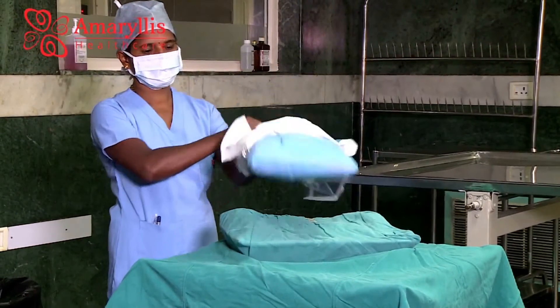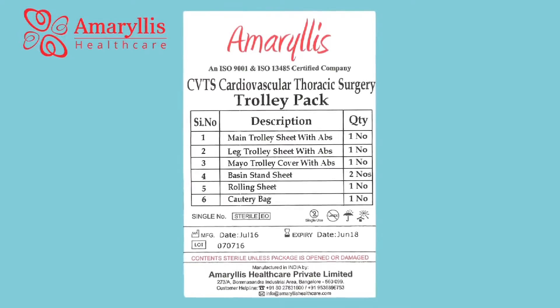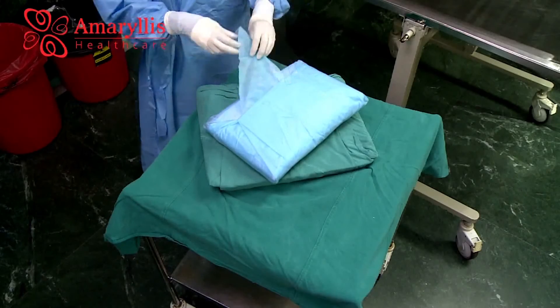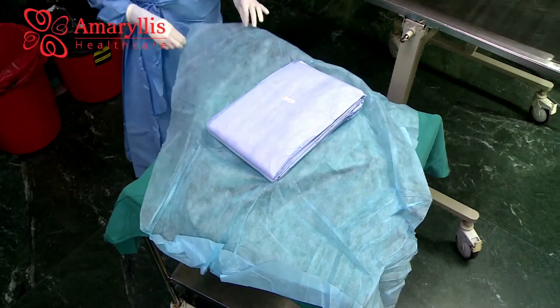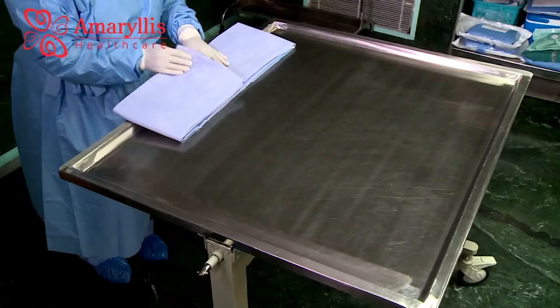The trolley pack contains: main trolley sheet with absorbent layer, mayo trolley cover with absorbent layer, leg trolley sheet with absorbent layer, basin stand sheet, and rolling sheet. The main trolley sheet is used to cover the main trolley.